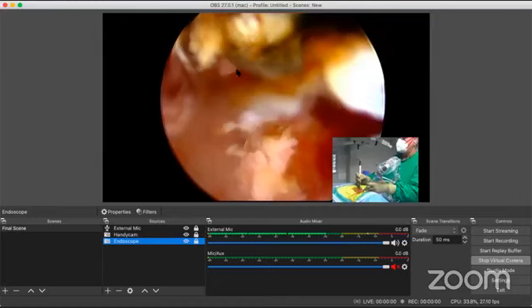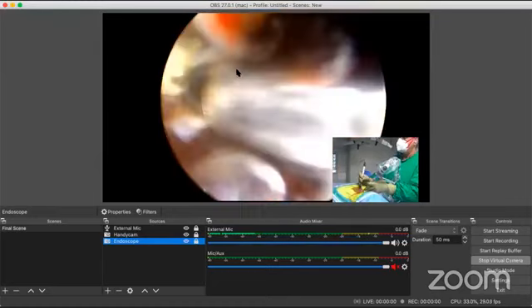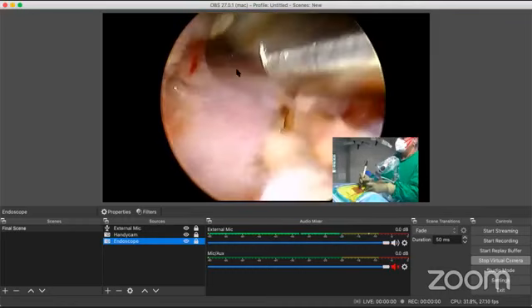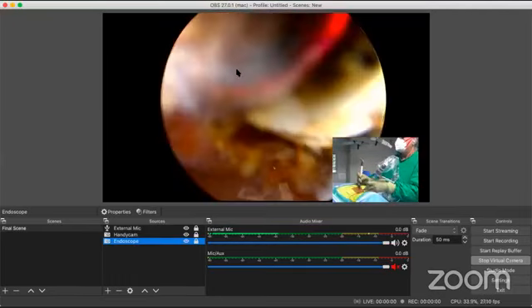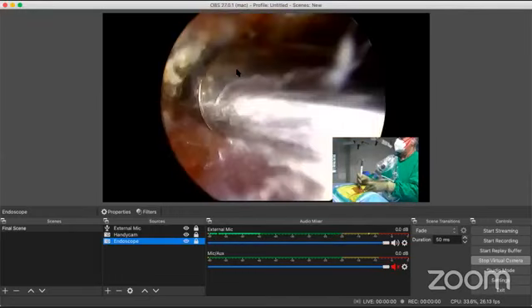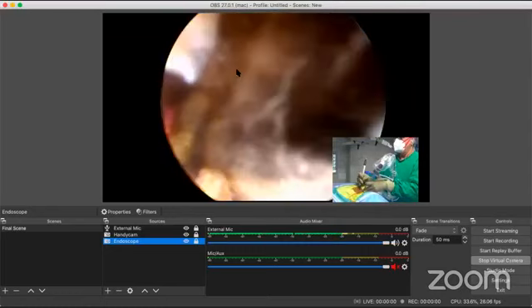No heroics like last time. We are going to be very slow and gentle. We want our patient relieved and I as a relieved surgeon at the end of the day. Cervical spine is not a surgery where you hurry up.